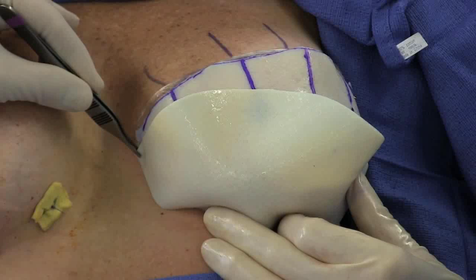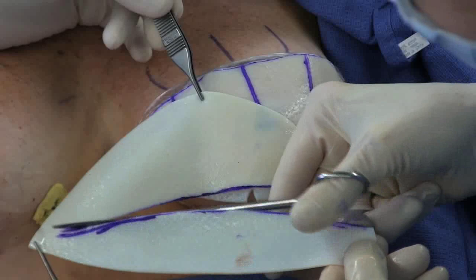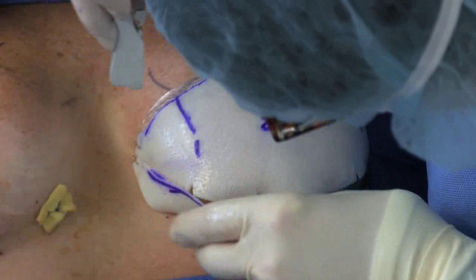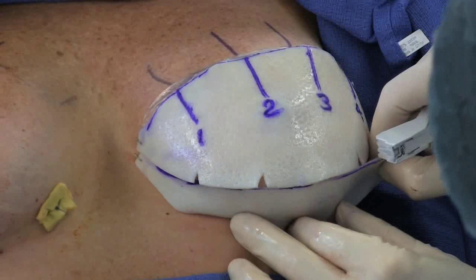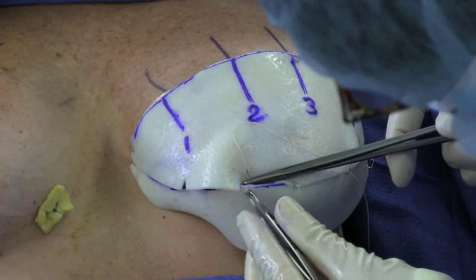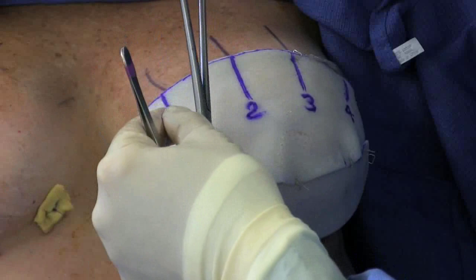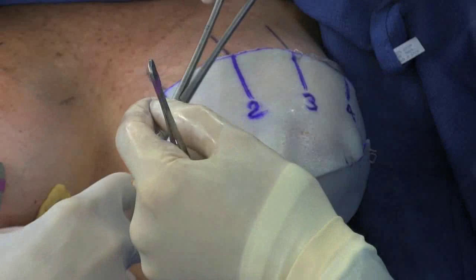A second piece of ADM is then fashioned to complete coverage down to the level of the inframammary crease. The two pieces are then sutured together. The suture location marks are then transferred to the second piece.